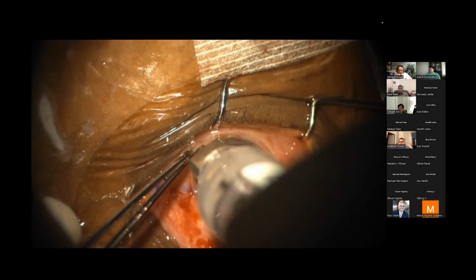It happens once in a while if you have a very loose zonule and the lens can move back and forth. I've certainly seen it, but it's pretty rare. And I agree with everybody that I wouldn't be aggressive. If you leave the eye relatively soft and everything is back, it's probably not going to be an issue. And you can have the patient face down anyway for the first 24 hours, and you see how it behaves.